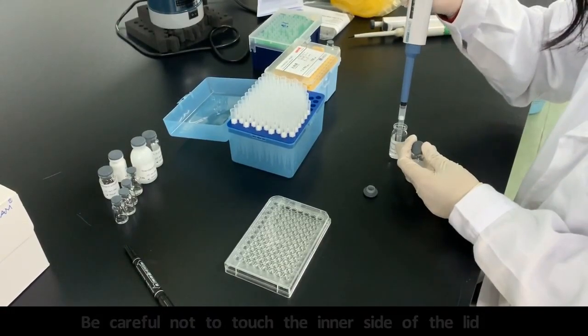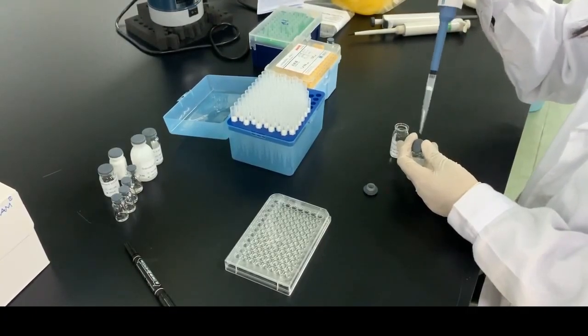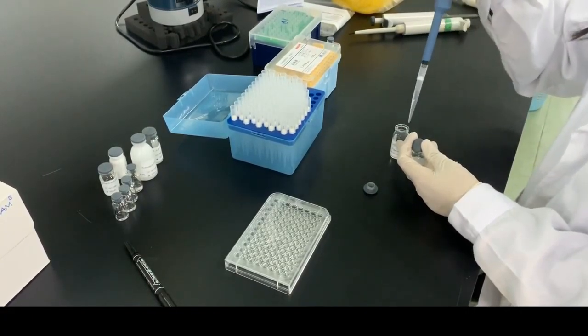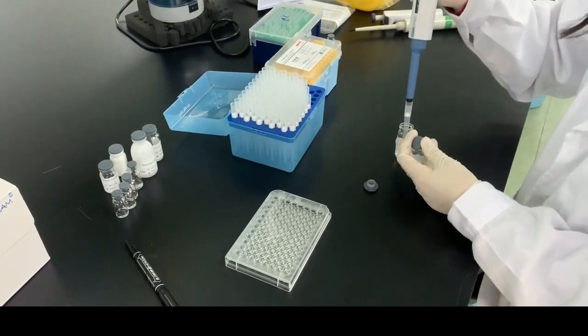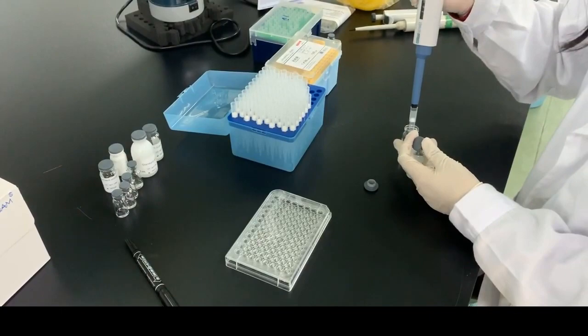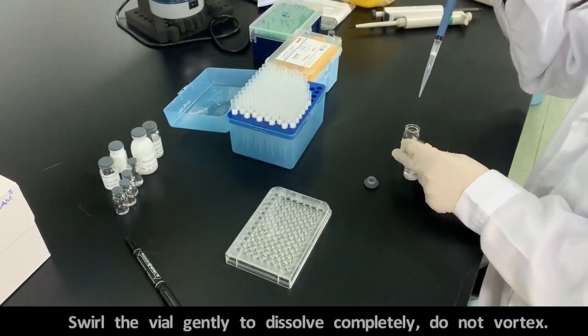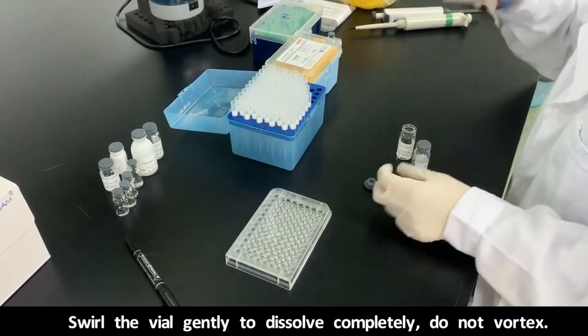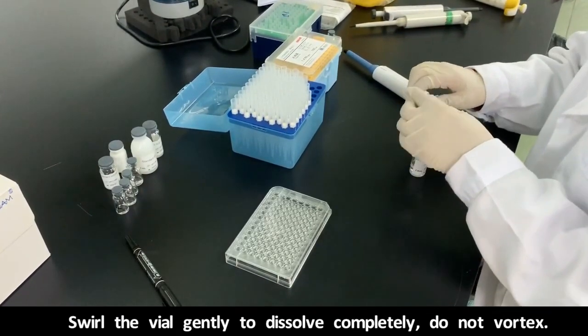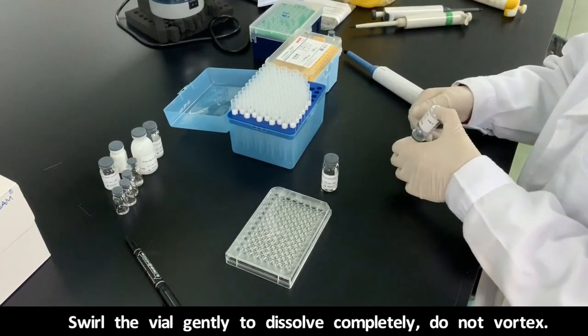It's important when you're holding the lid of this reagent buffer not to touch the inside of the lid. And you gently mix this to ensure mixing. Obviously, you don't want any extraneous glucan added to the assay at this stage.